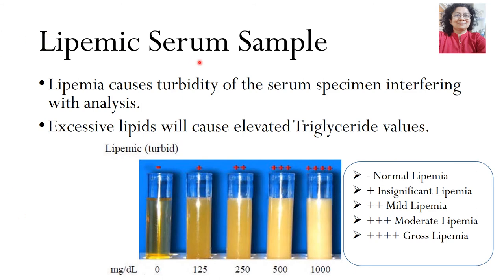Next is the lipemic serum sample. Lipemia is turbidity of the serum specimen due to the presence of lipoproteins or chylomicrons. The excessive lipids will cause elevated triglyceride values and will also interfere with various other parameters. The degree of lipemia is graded using a blue sheet — if a black line is drawn across it, the visibility of the line will change, and there are grades based on this.